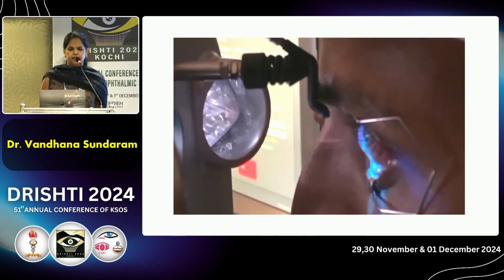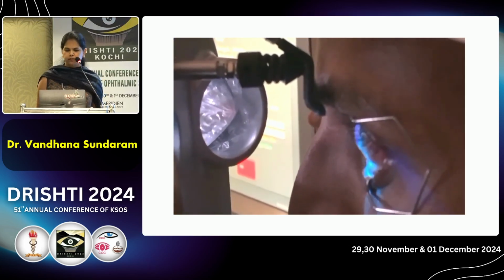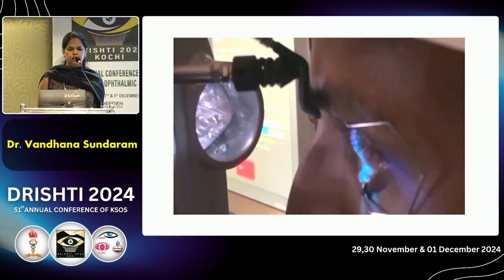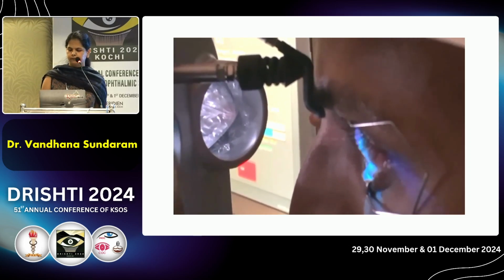Here you can see a live video of a patient who is undergoing surface ablation in sitting position. The patient was a case of Bowman's dystrophy, and he is undergoing PTK of around 250 microns. You can see that there is good fixation as well as a flying spot laser.